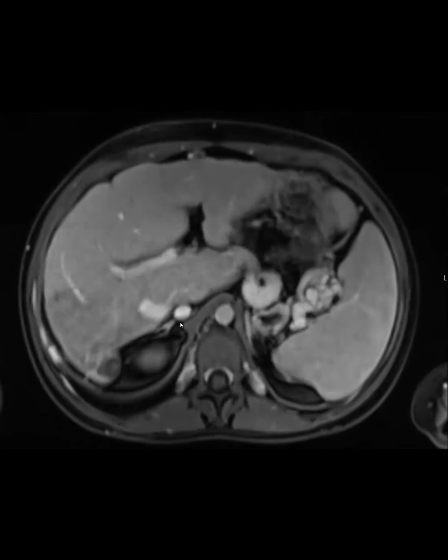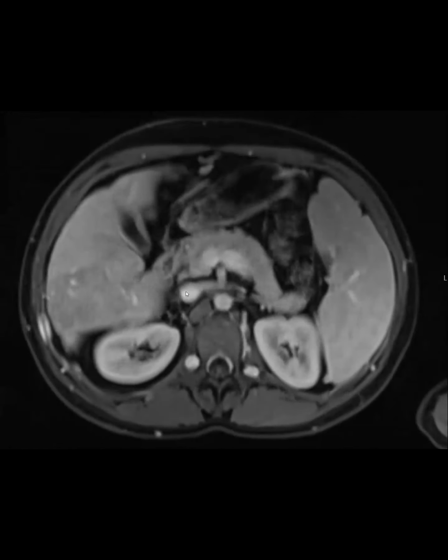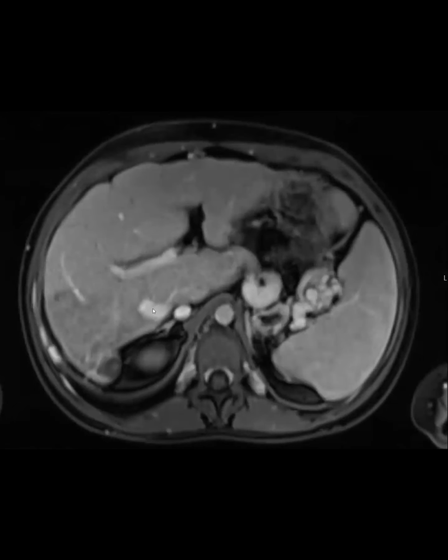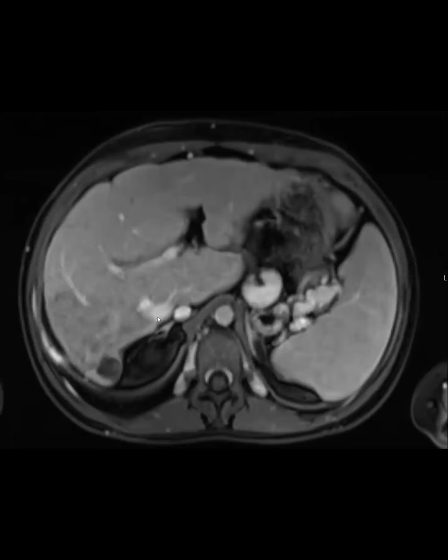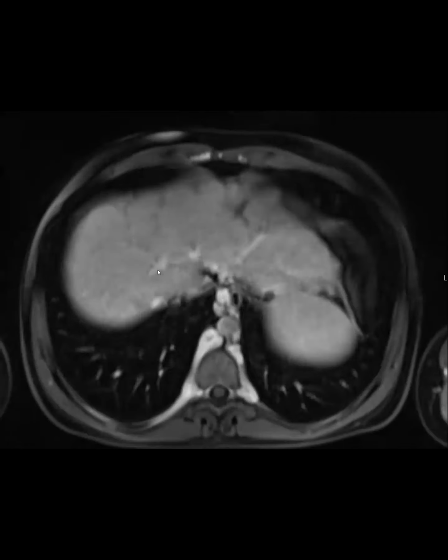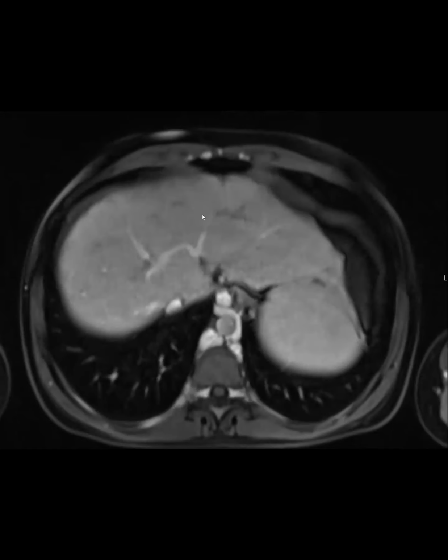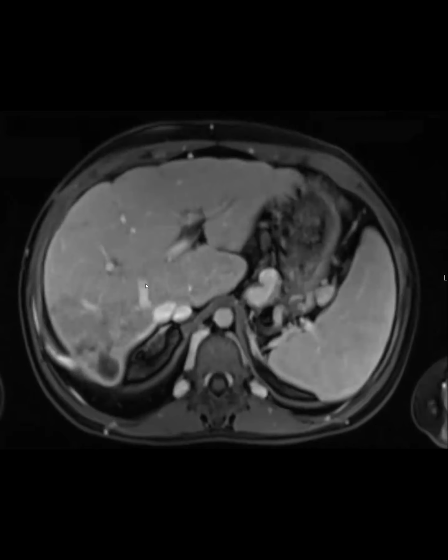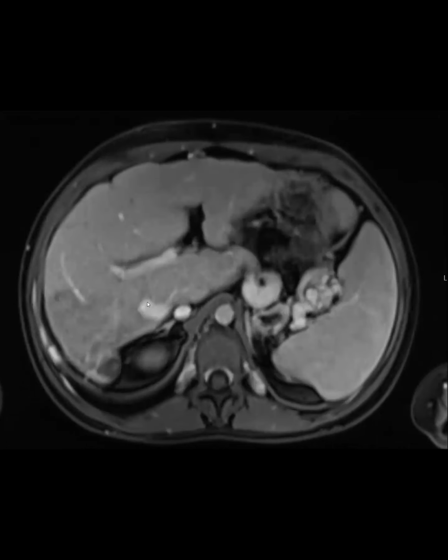Yeah. So I'll just show it to you again. Okay, so here we've got the IVC. It comes up and normally goes into the liver, but instead we've got this other weird vessel here. This is actually an intrahepatic collateral vessel. See these veins here are forming this web of veins that are now draining into the IVC through this big collateral here.